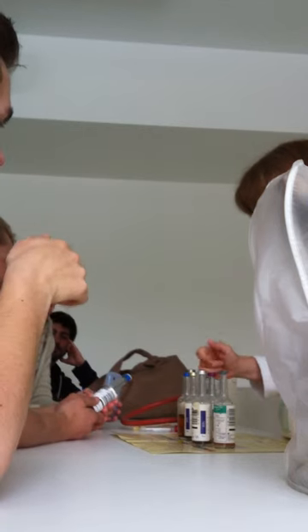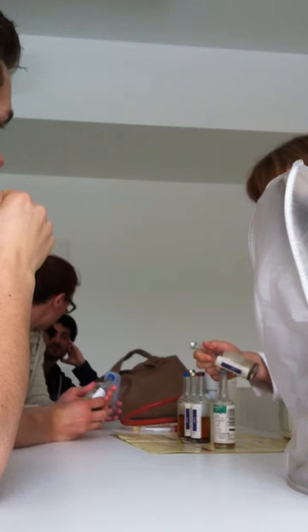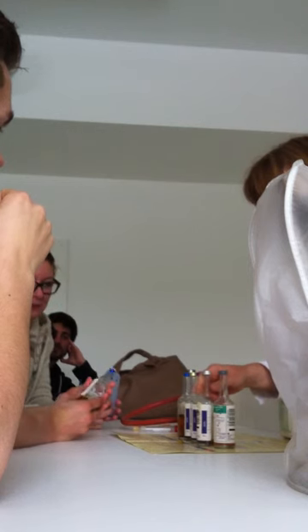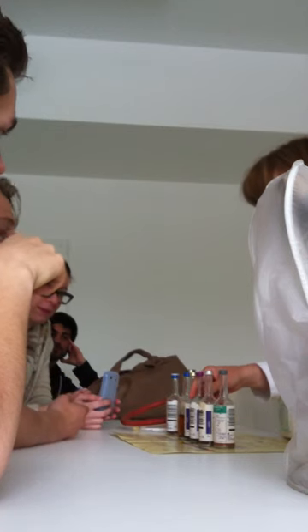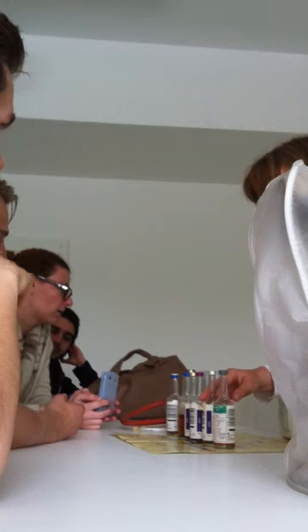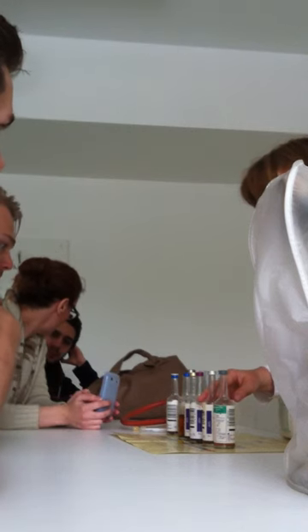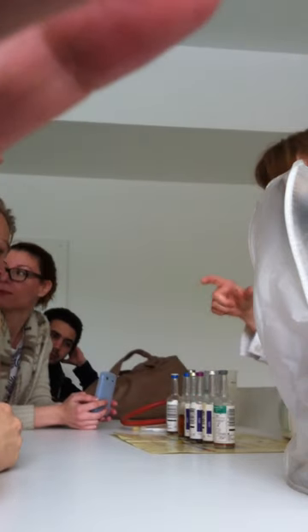So less vacuum in the bottle? No, not less vacuum. Less blood should be inoculated into this bottle. But is there vacuum inside these? There is a vacuum inside, but it's not measured. I mean, you don't know how much, so it's not appropriate to use for bacteria because this is not the appropriate amount of blood.